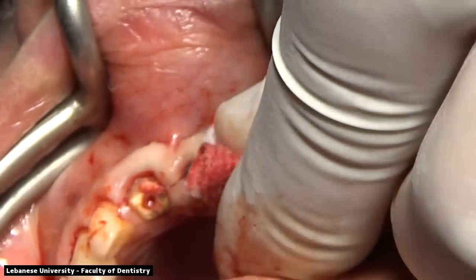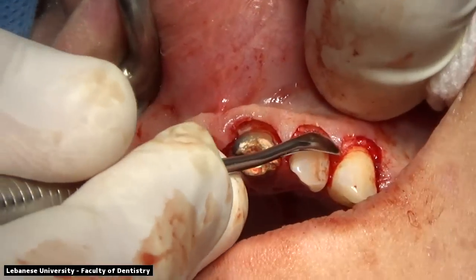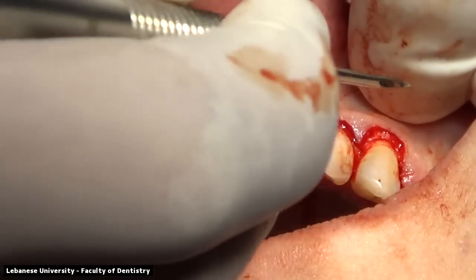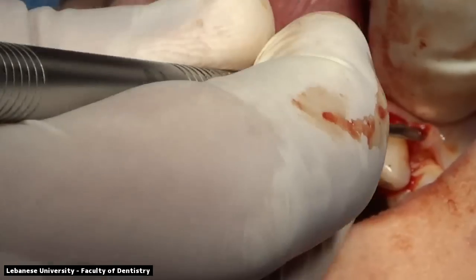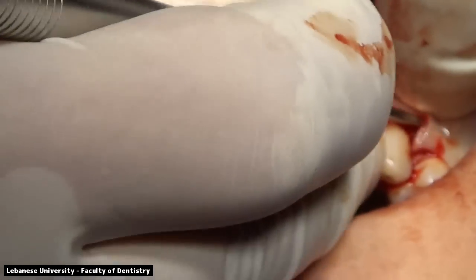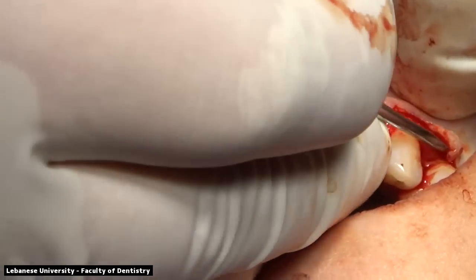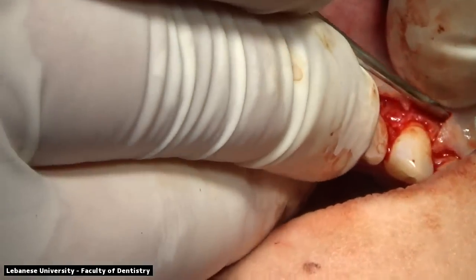Always use a moist gauze, a gauze that has been impregnated with some saline. This will avoid tearing of the soft tissue and adhesion of the cotton into the flap material. What we can see is that the bone is being exposed right now. We're elevating beyond the mucogingival border, starting of course with the papillas, making sure that the papillas are completely intact, and elevating all the way to the mucogingival border.